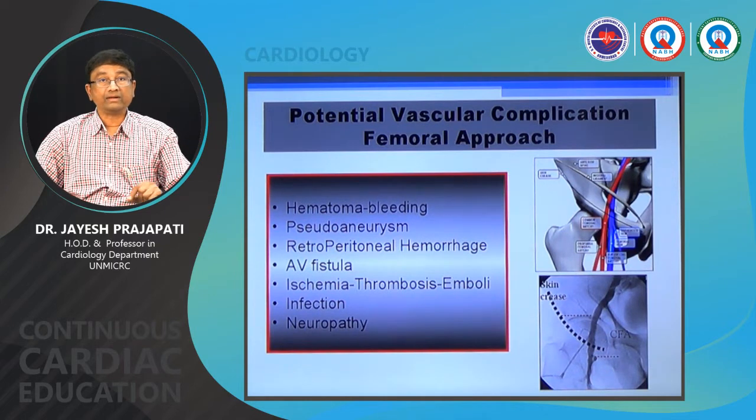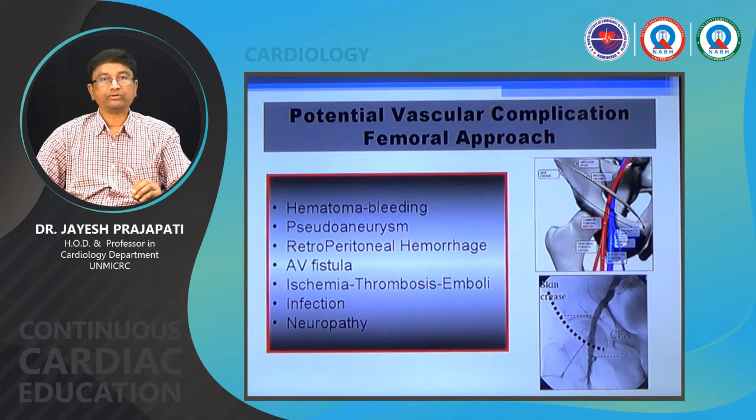Another way to localize the hematoma: the biggest thing you have to see on fluoro is the bladder shadow. If the bladder shadow is compressed or moved to one side, always look for a hematoma. This is one thing you have to keep in mind.